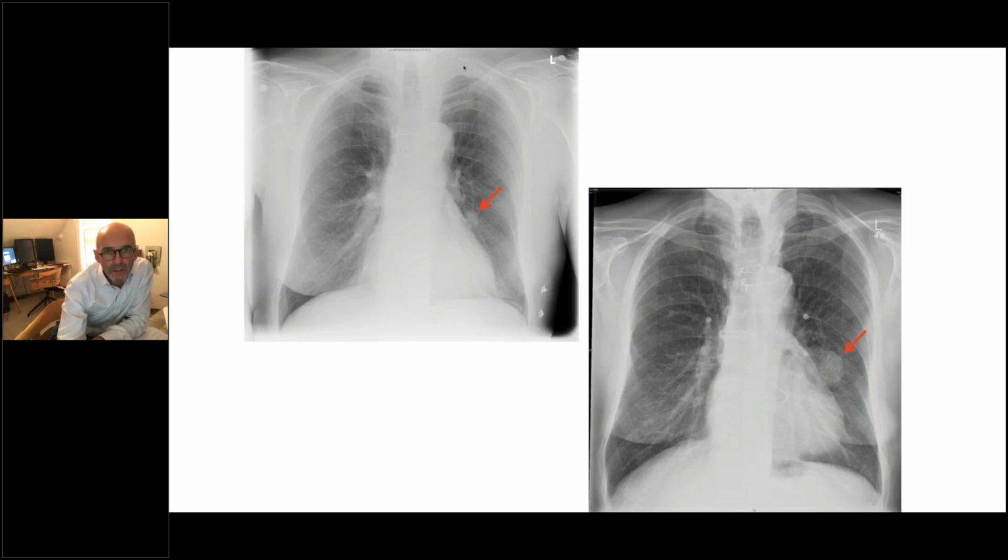Here is one that we missed earlier, so to speak, many years ago from around our region. And you look at it and you think that's a really obvious nodule. But actually, a couple of years later, it had got bigger and you could look back and see it. Now, we don't know whether that radiologist was answering the phone or asked something else at the time. We have no idea why they missed that. And we want to know whether AI can help us.